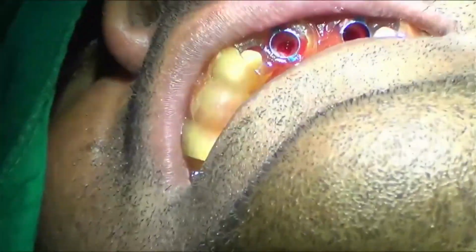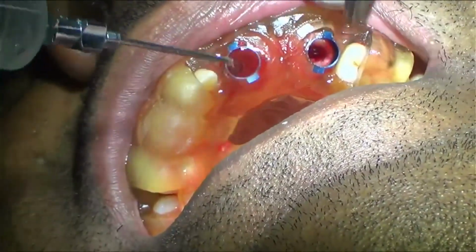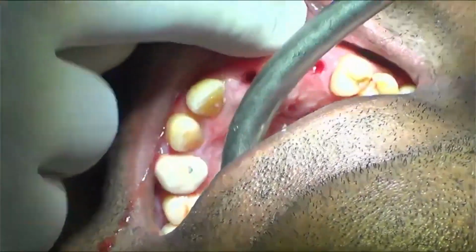Now my osteotomy is done. And before I put my implant, I want to inspect my osteotomy completion.